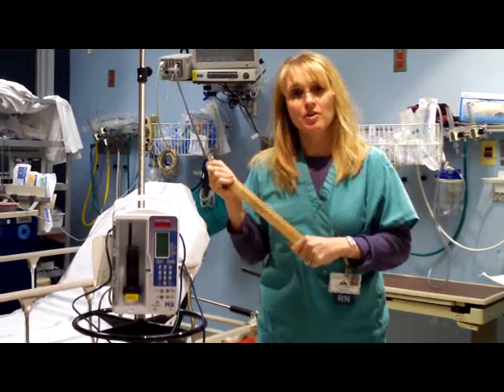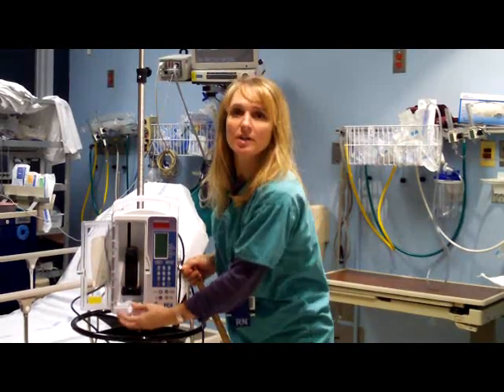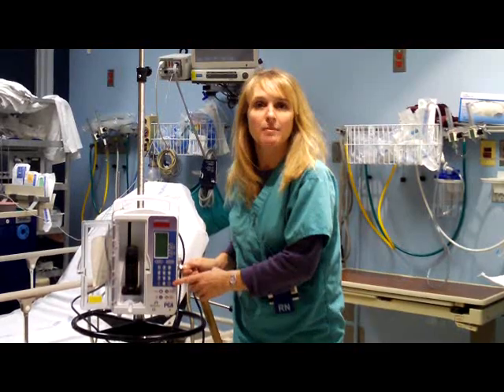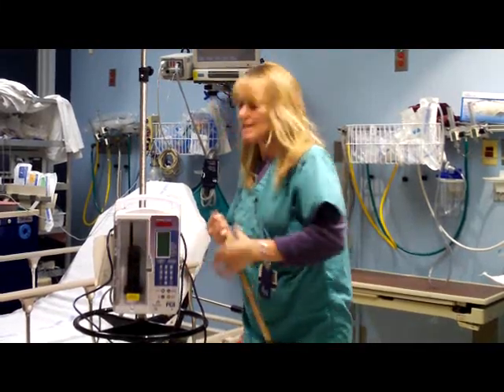there's a key on every nurse's station which will unlock the PCA machine itself. The medication is inserted in through here, and this is where you program the PCA for whatever settings the doctor ordered. Once the medication is all set up, it's locked.